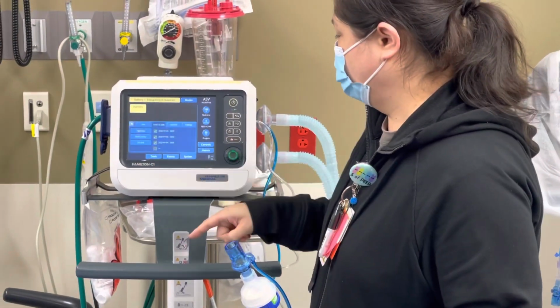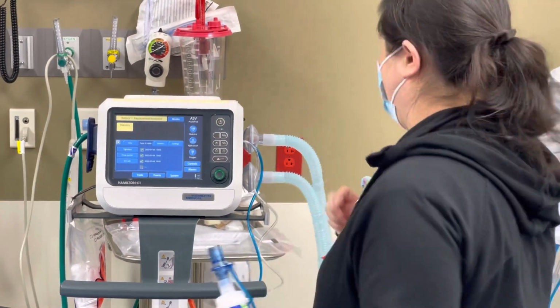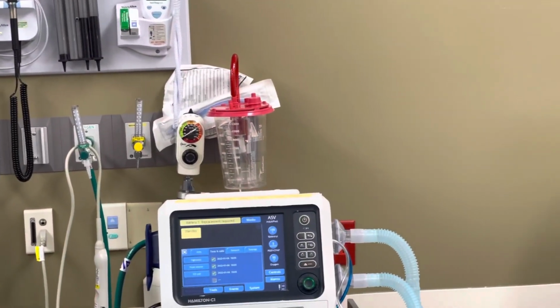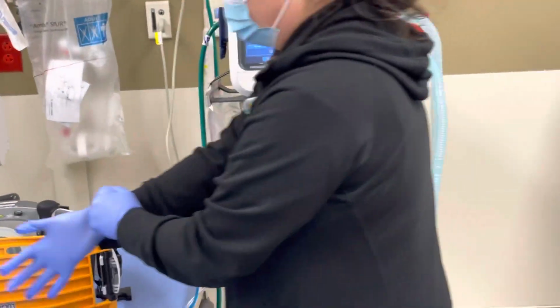So when you do your pre-op check, you're gonna do your first one, which, all right, I'm just gonna, here. Let me grab a glove real quick, sorry. I didn't wanna put my hand over the end of that clean flow sensor.